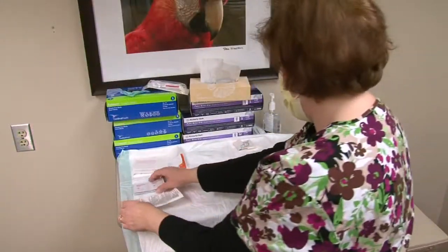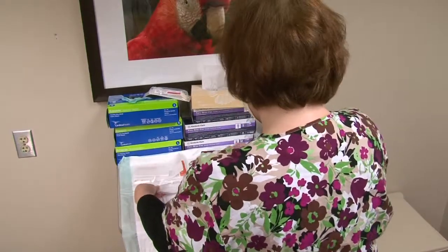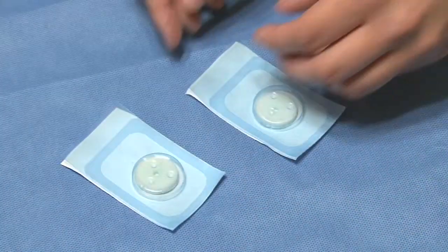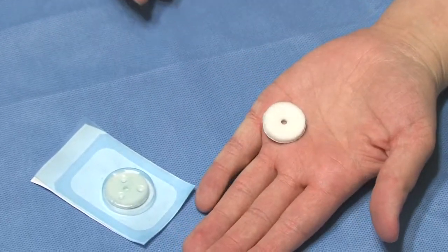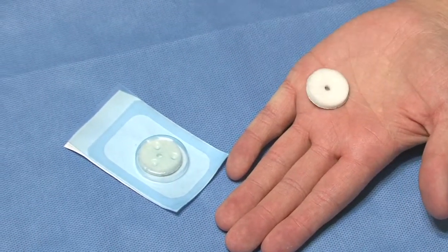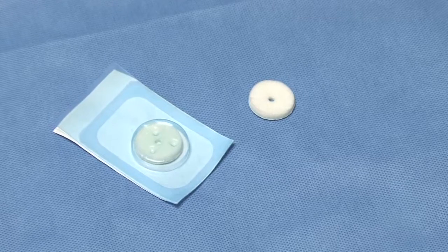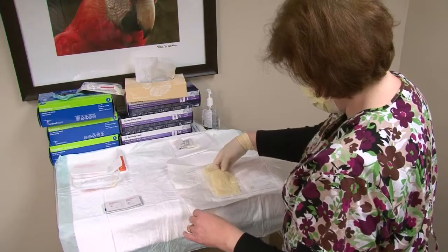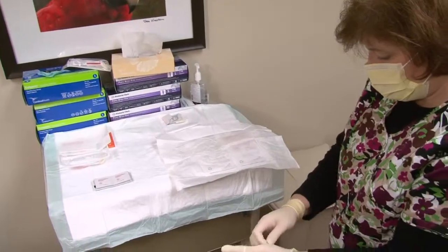Your care provider might use a central line dressing kit that contains all the supplies needed for the procedure, or your care provider may open individual supplies that are not contained within one package. Some agencies may use a special type of dressing that has chlorhexidine embedded in the dressing material or in a small round sponge-like disc that will be applied directly over the catheter exit site. Use of these types of dressings is determined by agency policy. Some providers will use them, others may not. The important thing is that proper procedures are followed during the dressing change and anytime the central line is accessed to help keep you from having complications such as infections.